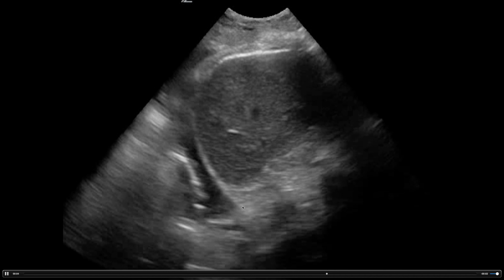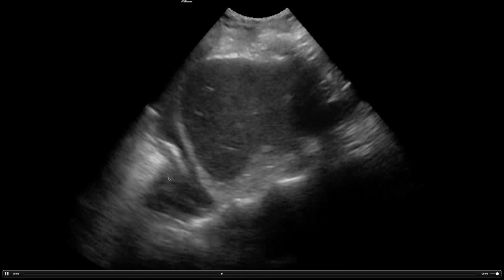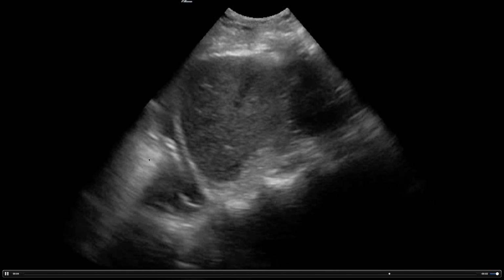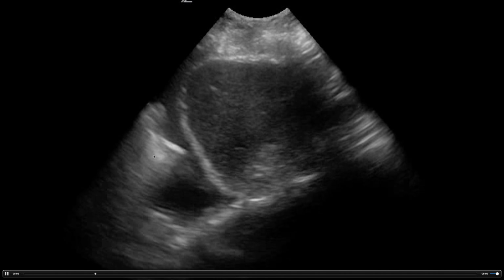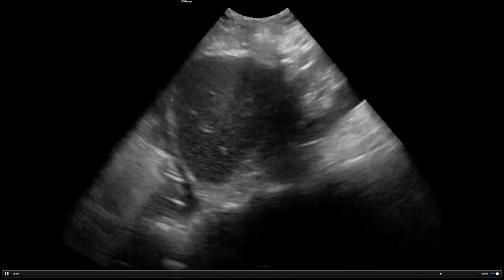So in this case, spine going above the diaphragm, and there's a large pleural effusion here with a consolidated or atelectatic lung floating in the fluid. Again, something is letting ultrasound beams come all the way down.